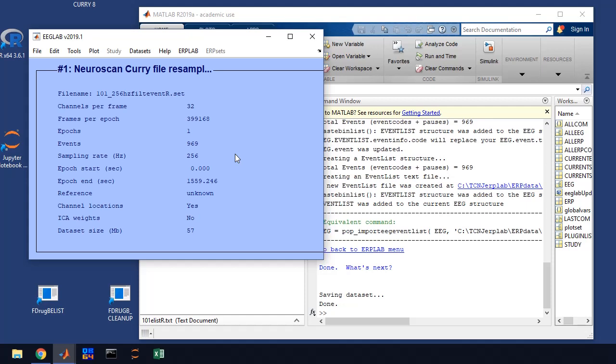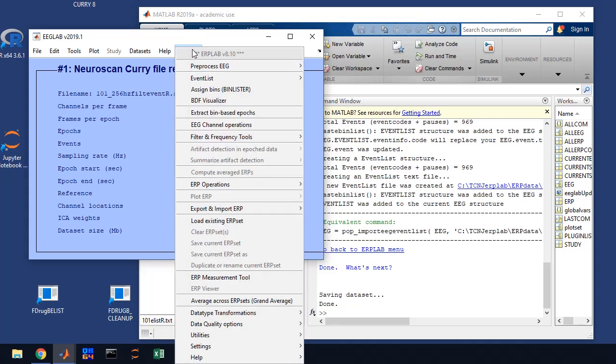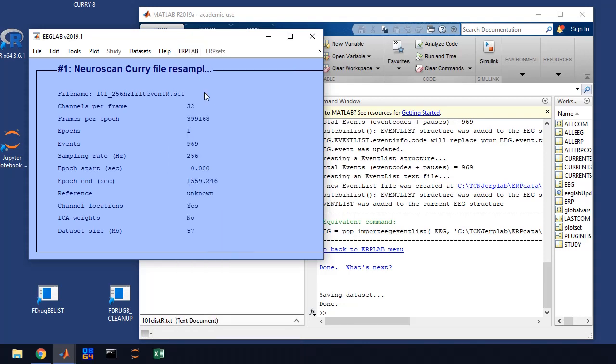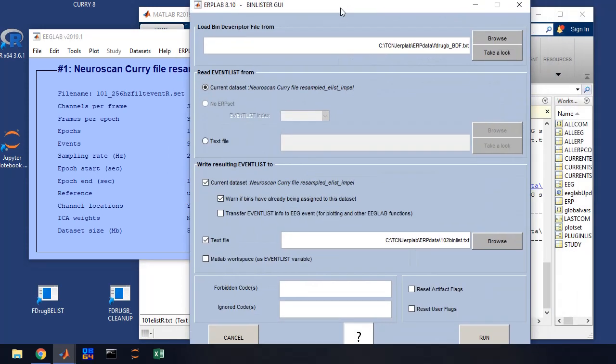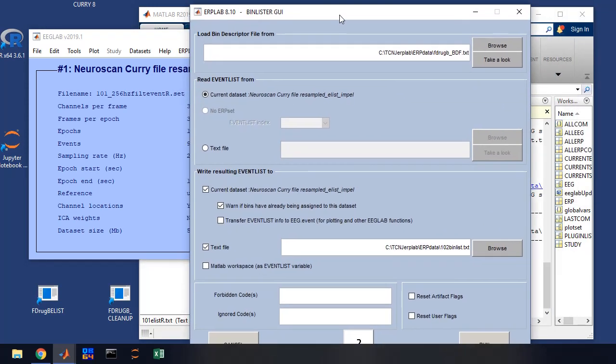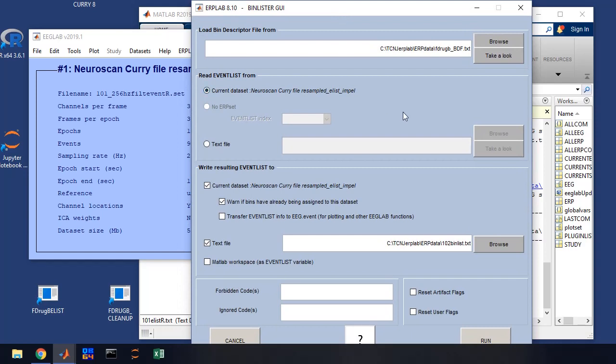So that's fantastic. So the next thing that we want to do is we want to assign various epochs to bins. Part of how we decide what items to sort and stuff, we have to decide this in advance, but we're going to form ERPs based on certain trials in our data set. So this is what we mean by putting them in various bins. Each ERP essentially would be one bin of items to average across. So the way we're going to do this is we're going to go to ERP Lab, assign bins using this bin lister routine. Now, the good news is for each study, we decide in advance, like I said, how we want to sort our ERPs. So this is our file here.